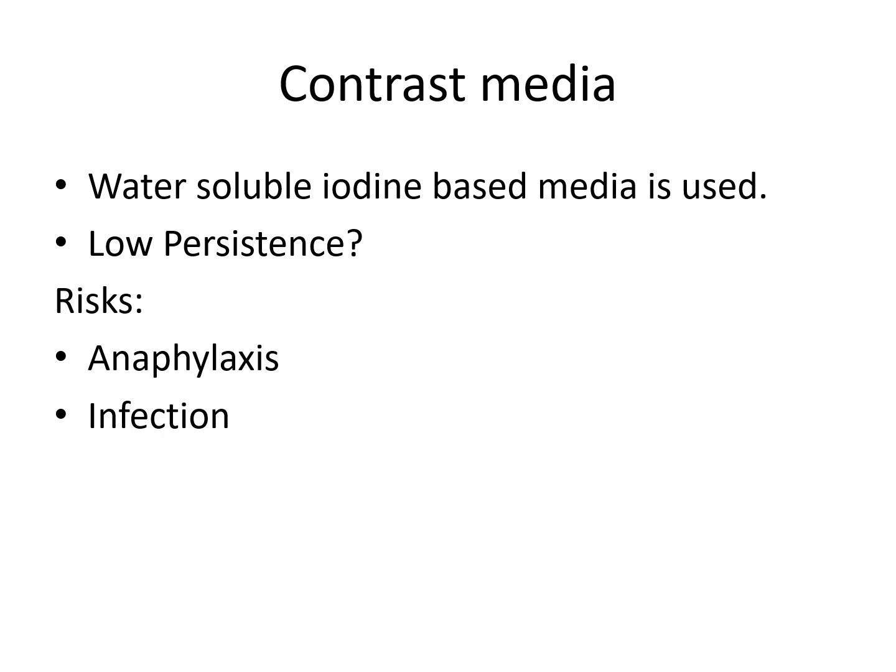Okay, the biliary system does like to drain fairly rapidly, so especially if you don't get pictures in short order of the biliary system, you might find yourself doing multiple injections. Typically, the iodine can drain out of the biliary system in as small as 20 minutes.